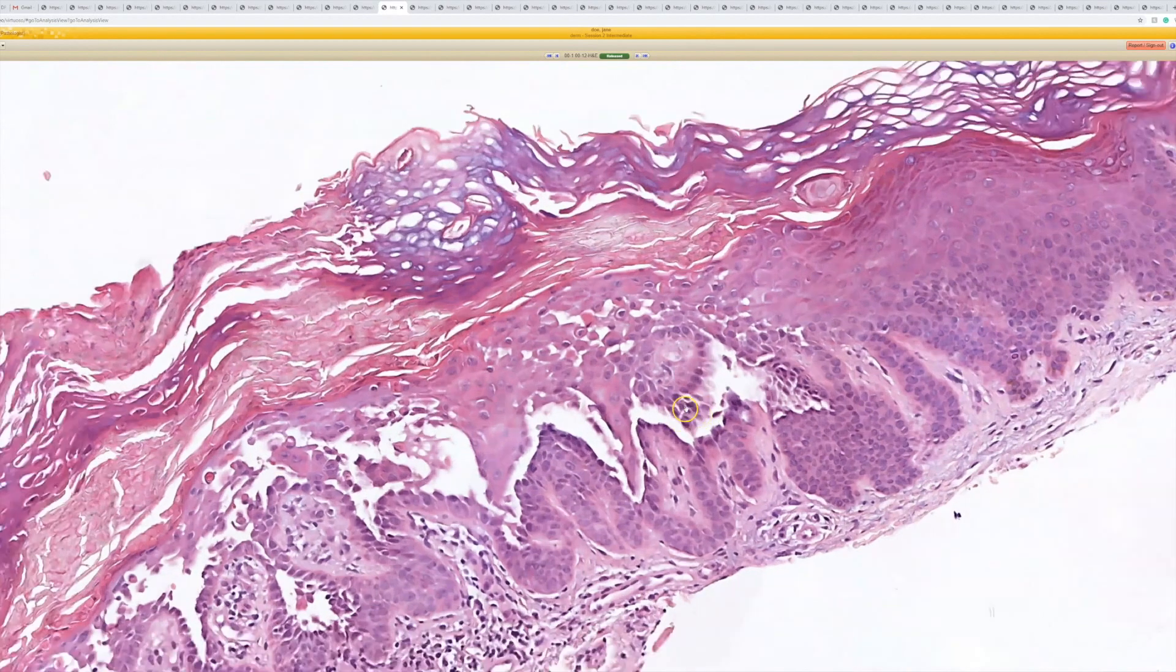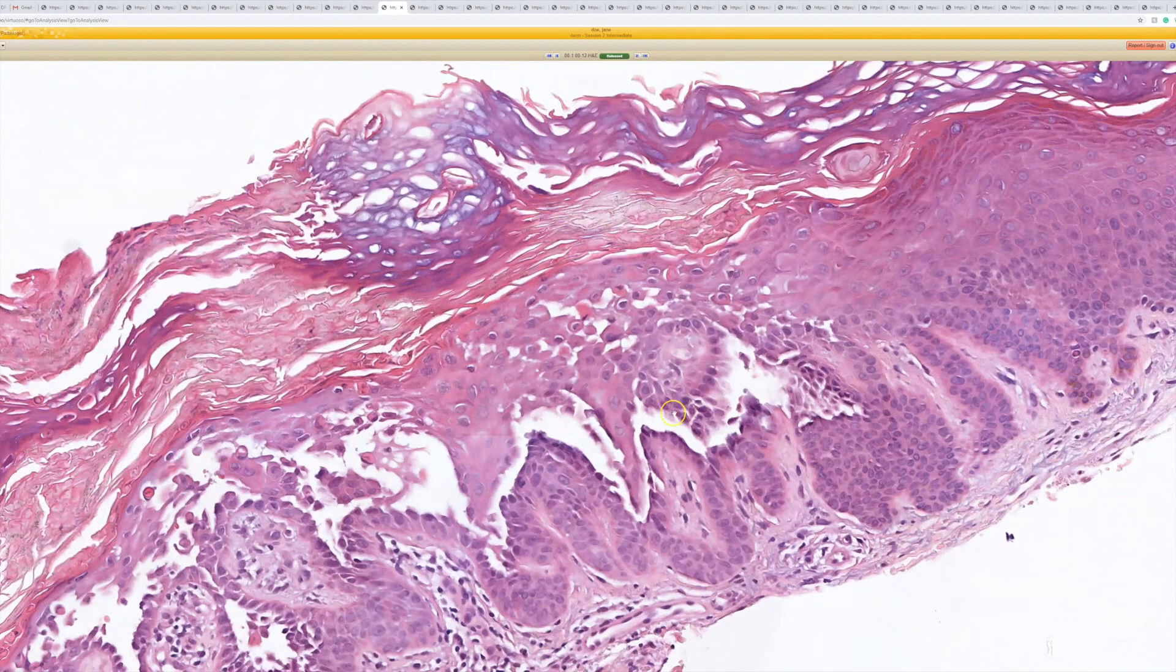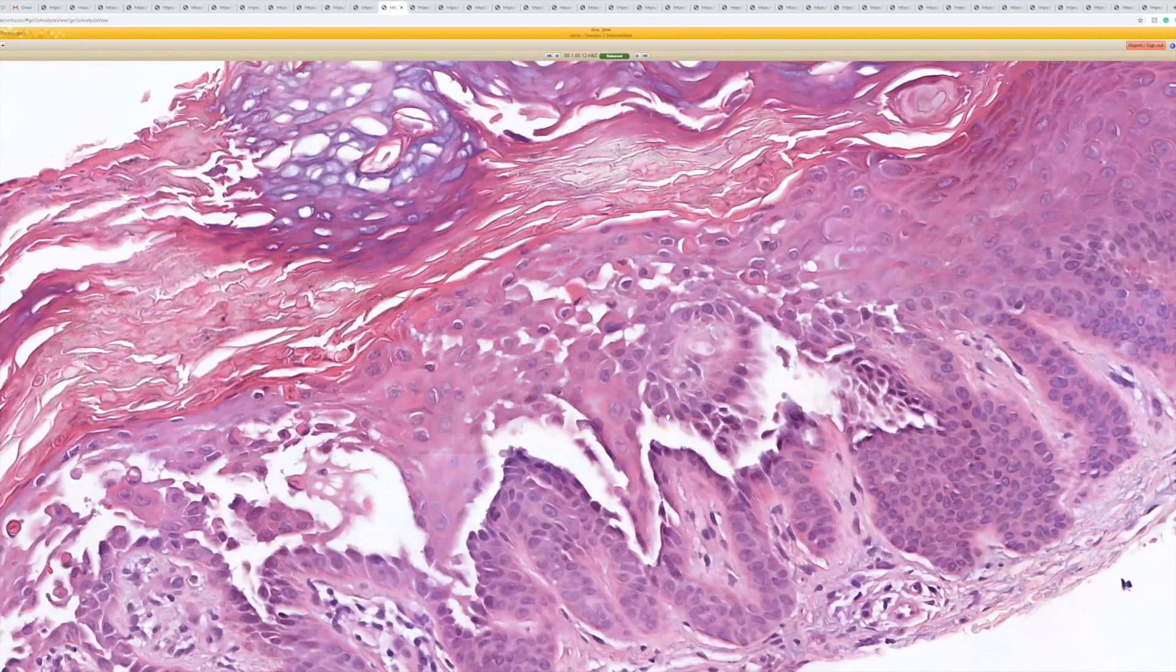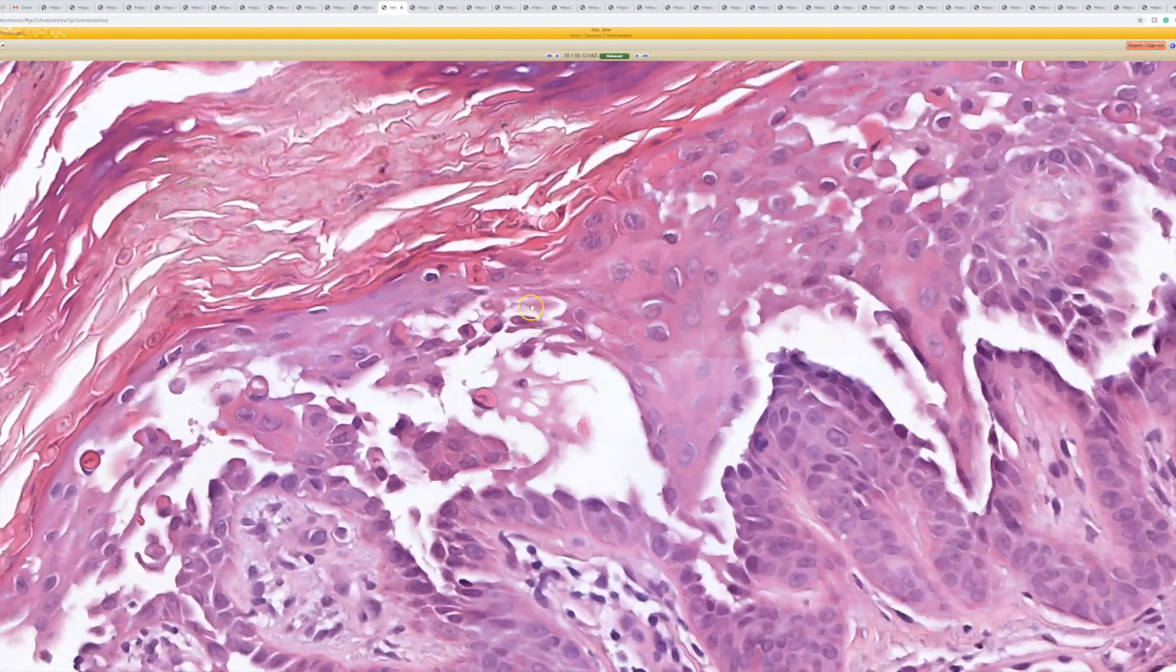This is another one of those where the pattern is acantholysis and dyskeratosis. We've got the cells falling apart. When they get acantholytic, they are not stretched out hooked up to their neighbor keratinocyte, so their cytoskeleton bunches up next to the nucleus. That makes it look a lot more dense pink because the keratin filaments, instead of being stretched out, are all bulged up around the nucleus, so it has a very dense pink look. That's one way that helps you tell that what you're dealing with is acantholysis.